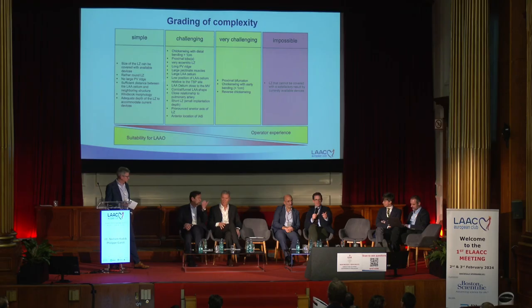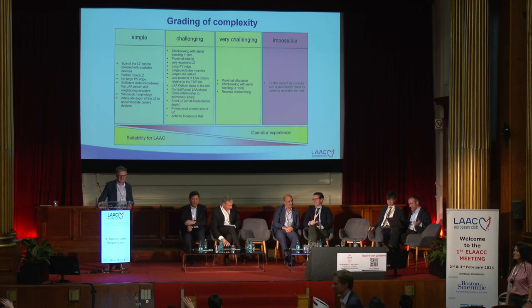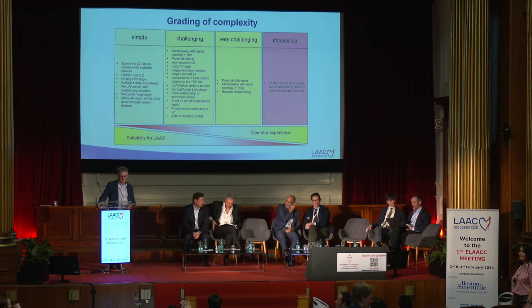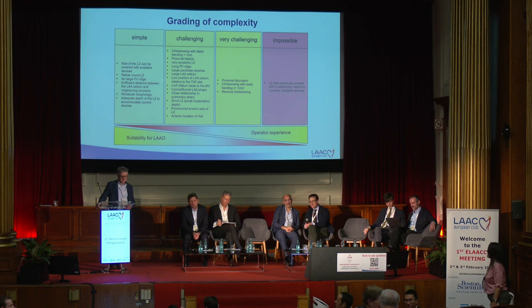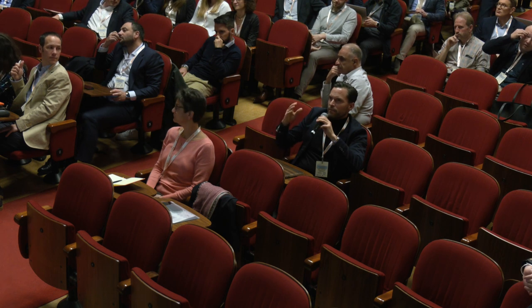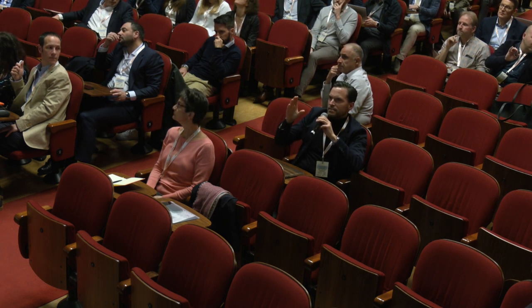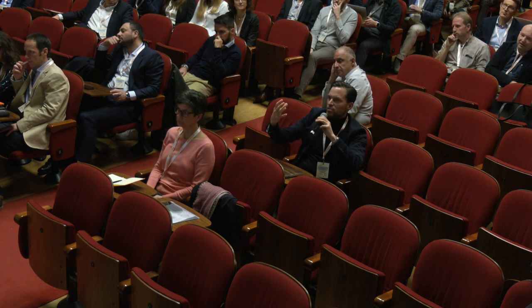But how would you call it then? You have to give it a name, no? Very challenging. And then you change it if it's impossible because you tried it and it's really impossible. Maybe very challenging and high risk of device failure. But simple, maybe not, but non-challenging. When I'm proctoring in inexperienced centers, that's the reason why I would go for non-challenging, maybe. But I think simple is okay. And just to make it more practical, even if it's somehow device specific, I would add some numbers for the device size or for the landing zone size, which is usually easy.